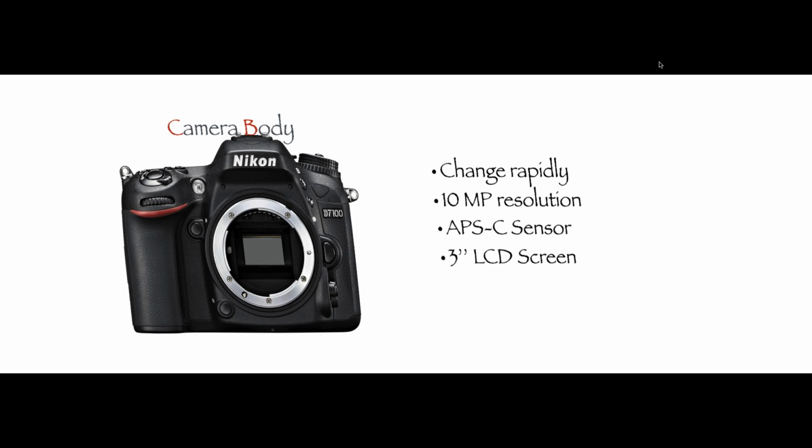I have another camera at home that I use for my family events, where I can spend anything I want. But for my practice, I need a basic camera. I just need to have a 10 megapixel resolution minimum.